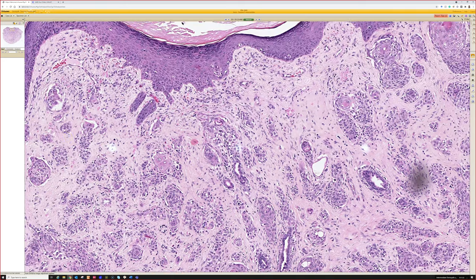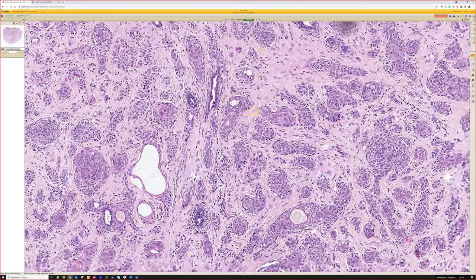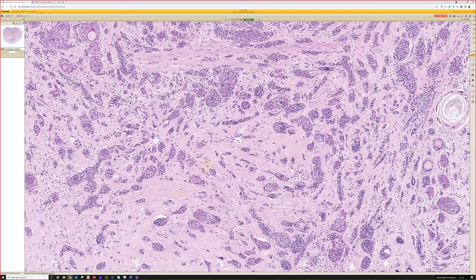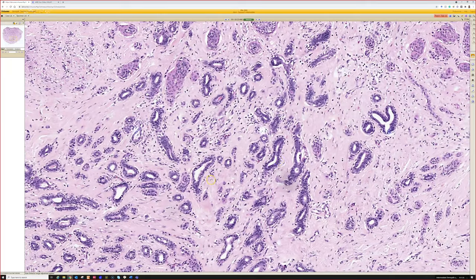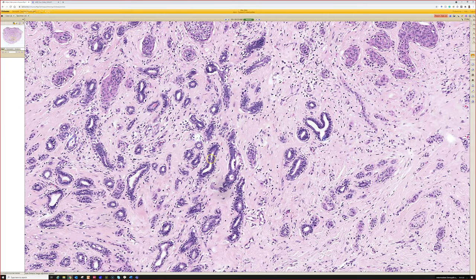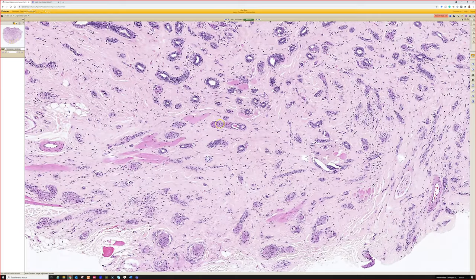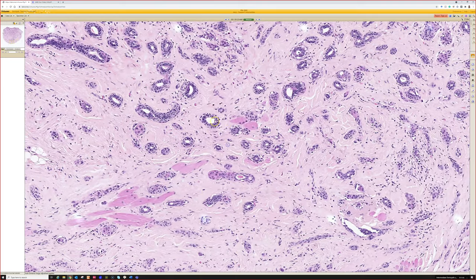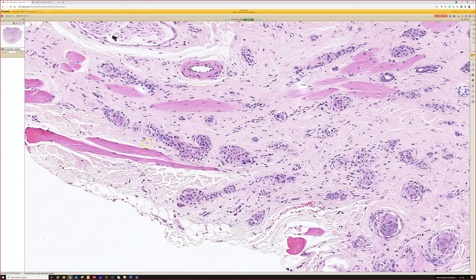But a lot of times, in my experience, up at the surface of the lesion, they don't have many duct spaces at all. It's really hard to see the ducts. They're very compressed. But when you go down deeper, I feel like you often see them better. But they do run a range of different features. But here, each one of these looks more or less like a normal sweat duct, but there's way too many of them, and they're infiltrating down into the skeletal muscle, way down deep.